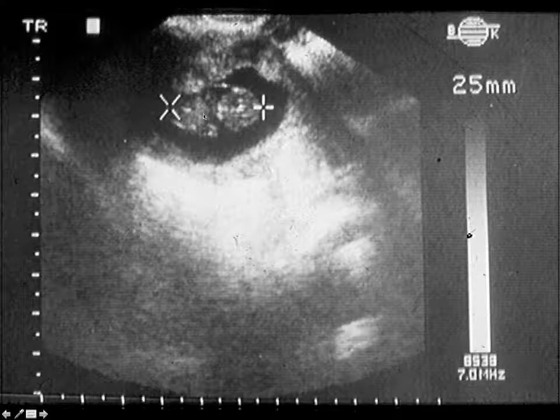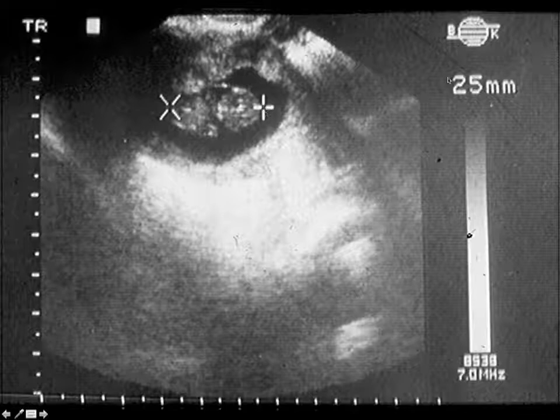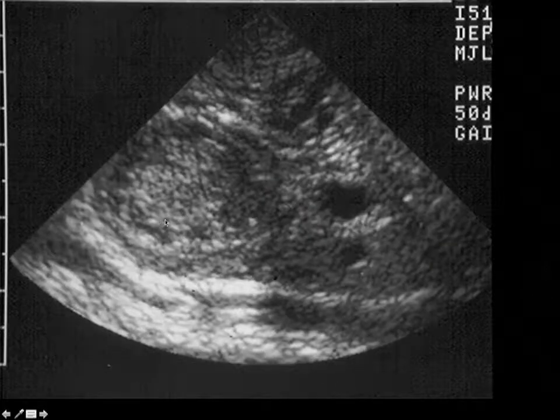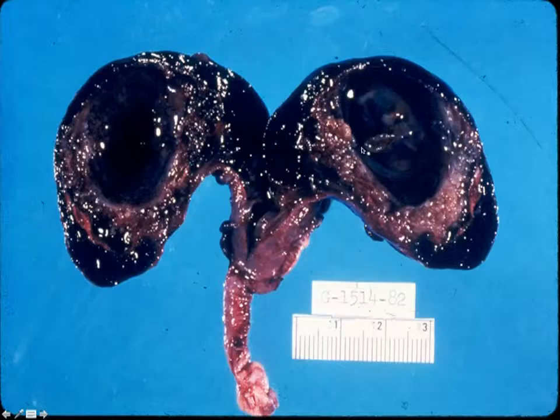And don't make the mistake the fellow at Bellevue almost made. Rule out ectopic, puts the probe in, saw this, was going to send her out. 25 millimeter crown rump length. Only problem is this is not in the uterus. He had never seen this degree of development in an extrauterine pregnancy. And I apologize, this is a technology called static arm scanner. And the reason I still showed this picture of an ultrasound is because I can't find a pathology that looks like this. Rarely do we do it with hysterectomy with the fetus, cornual pregnancy in situ. And many people would miss this ectopic because it was a mishmash of blood, clot, and fibrin.